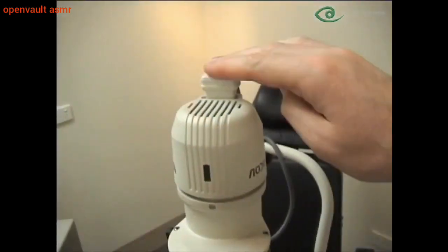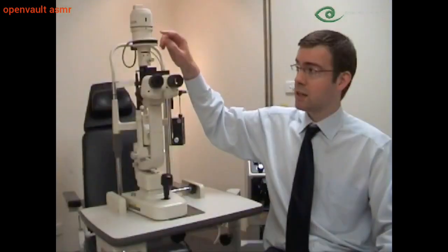going to the bulb. If that doesn't fix the problem, check that the filters are not halfway between two filters, and make sure that the width of the beam is set to wide. If those steps don't fix the problem, then perhaps the bulb is blown, or perhaps a fuse has popped, in which case you should speak to someone in your department who's able to service the slit lamp.